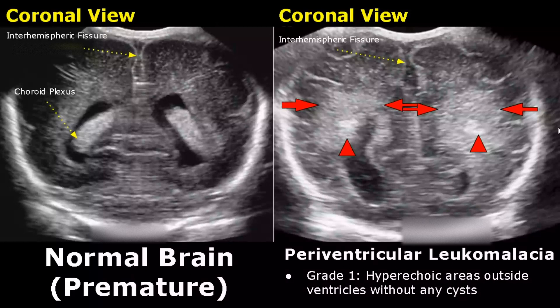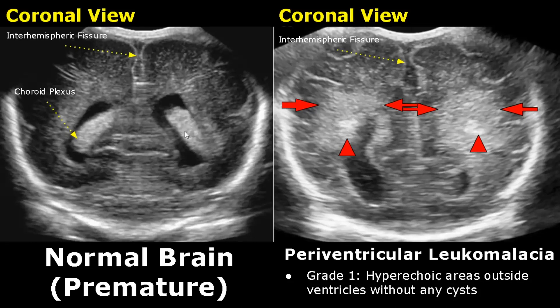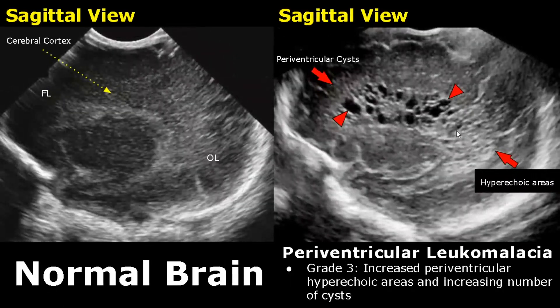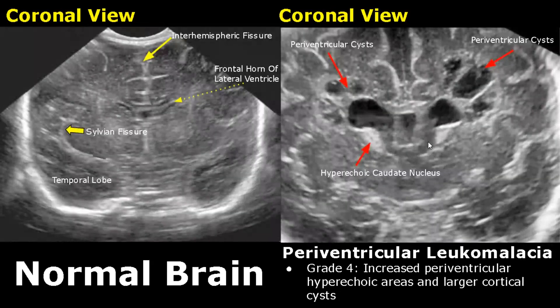This is a coronal image of a normal brain of a premature infant showing the choroid plexus. Periventricular leukomalacia affects the white matter of the brain and is graded by severity. In grade one, hyperechoic areas are seen outside the ventricles with no cystic areas. In grade two, multiple small cysts outside the ventricles are seen in addition to hyperechoic areas. In grade three, the number of cysts increases and the hyperechoic areas take up a larger area. In grade four, there are large cysts with greatly increased size.